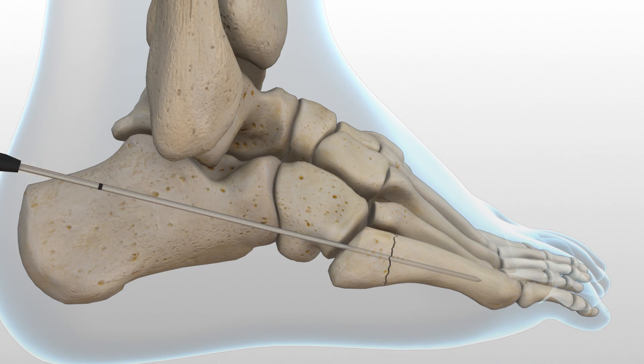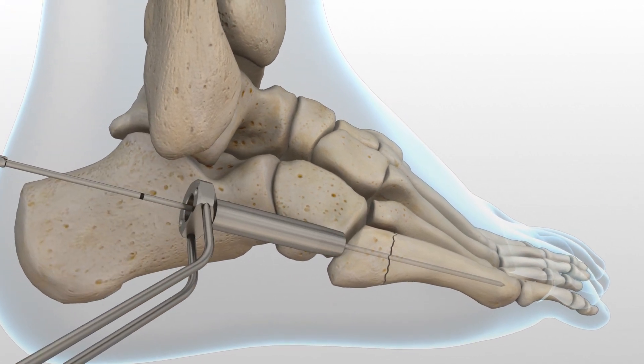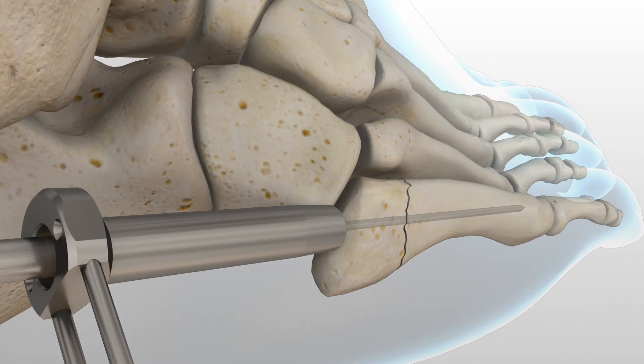After selecting the appropriate size, advance the guide wire approximately five millimeters to maintain distal pin fixation before drilling. Caution must be taken not to compromise any distal joint surfaces when advancing the guide wire. Place the soft tissue guide over the guide wire and drill the near cortex using the appropriate cannulated profile drill.